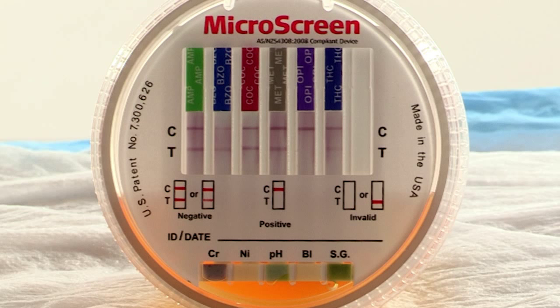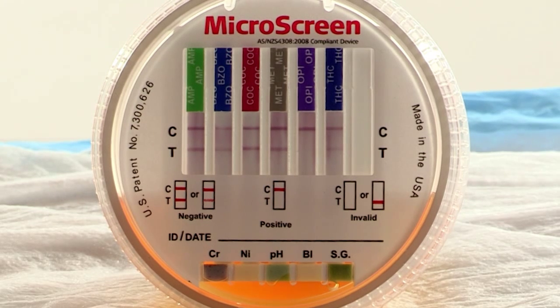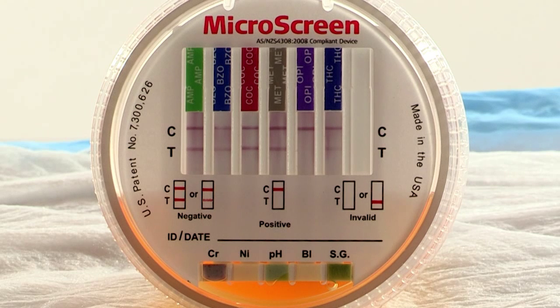When all the lines are present in the C zone, we can now read whether there are lines in the T zone, which is below the C zone. And in this case, we actually have a line missing in the T zone on the opiate strip.